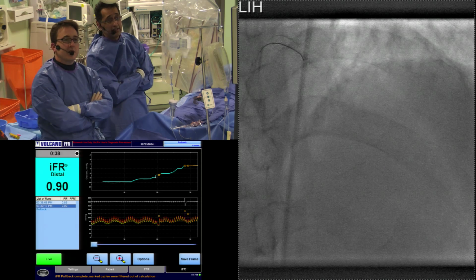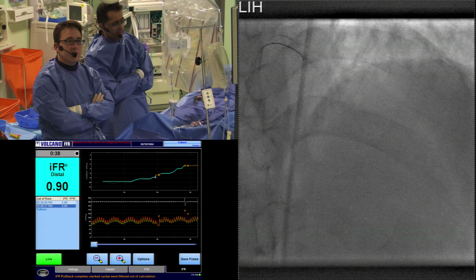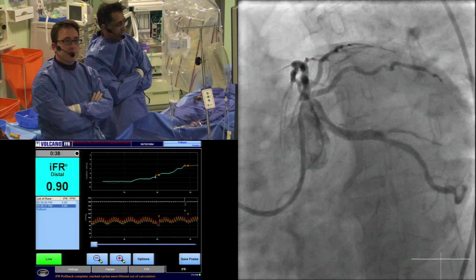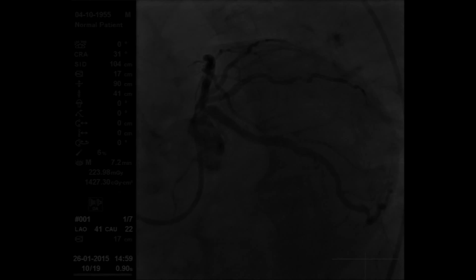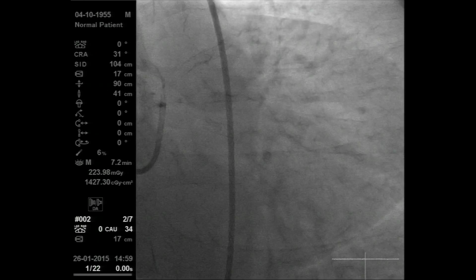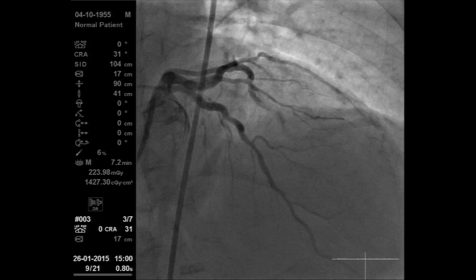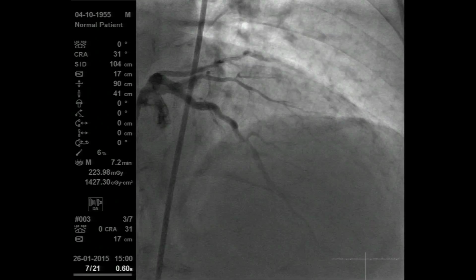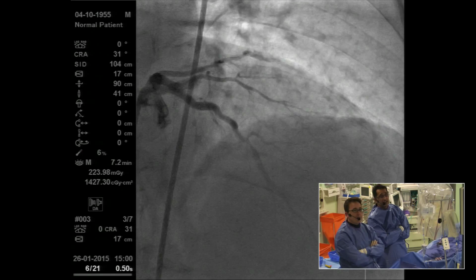So let's play the angiogram, okay, and let's play the cranial view, please, the one that we road mapped, and move forward to, there we go, okay. So one can see on that view that it's a pretty diffuse disease segment. This is now with nitrates, so unlike the diagnostic pictures, and I think you can see at that third diagonal, really, there may be a little bit of diffuse disease. At the second diagonal, it looks as though there may be more of a pinch.